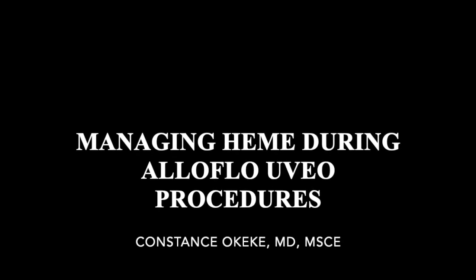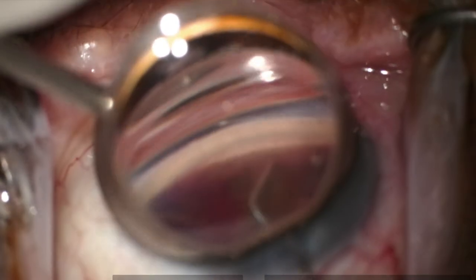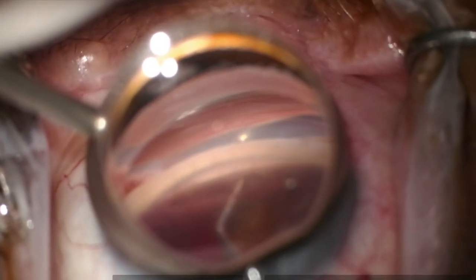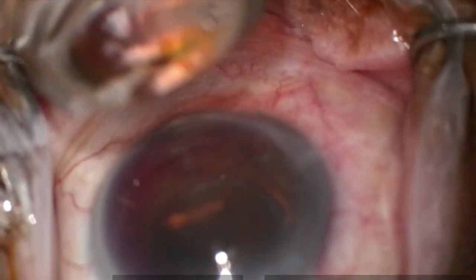Managing heme during AlloFlo Uveo procedures. Intraoperative heme can occur during cyclodialysis creation and implantation, and understanding how to manage it is key to maintaining visualization and procedural confidence. Not all heme is concerning.